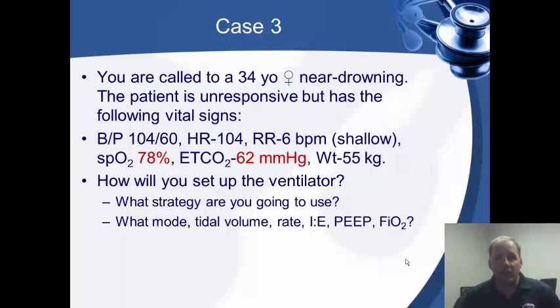How are you going to set up the ventilator? What strategy do you plan to use? Is this patient obstructed, or are we going to consider lung injury strategy? So what mode, what tidal volume, rate, IE, got to consider all these different variables.